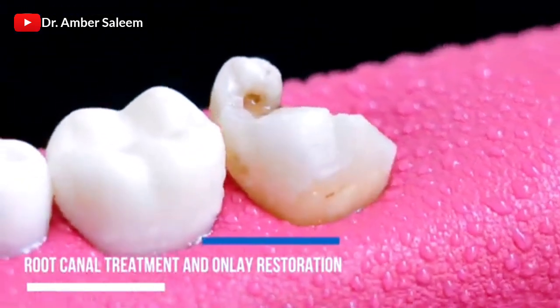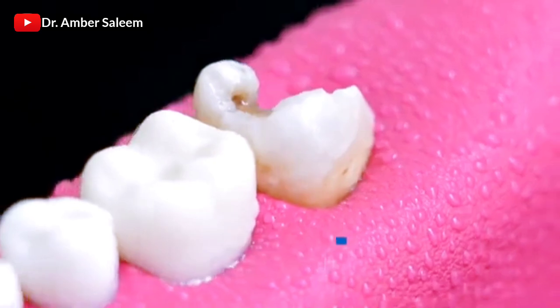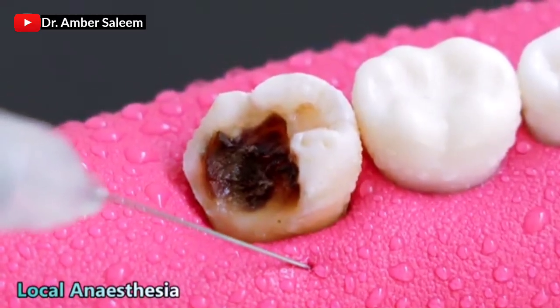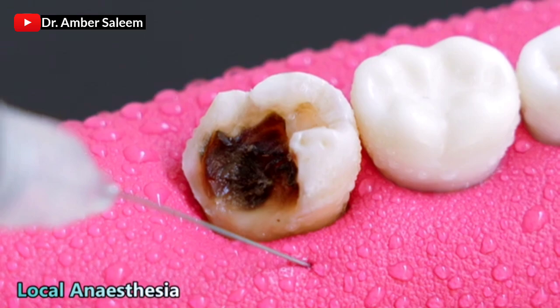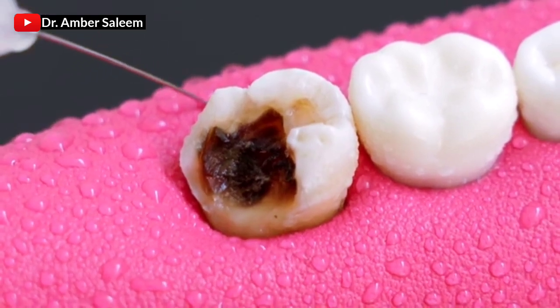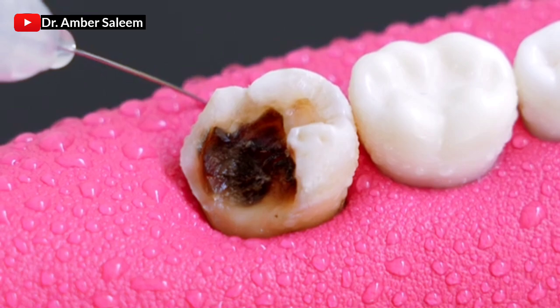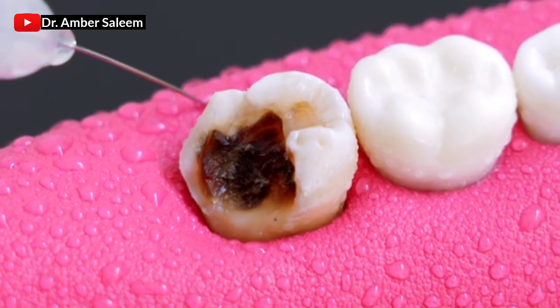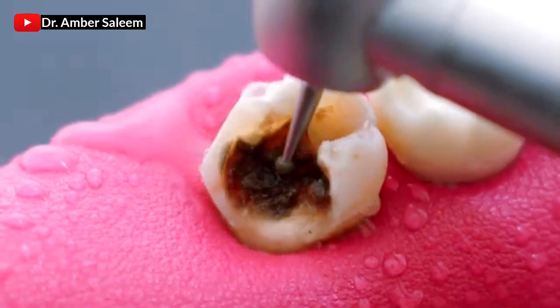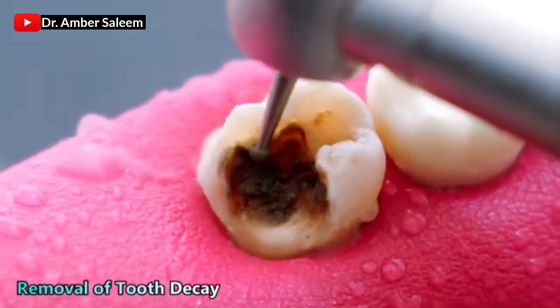Root canal treatment and Onlay restoration. Local anesthesia. Removal of tooth decay.